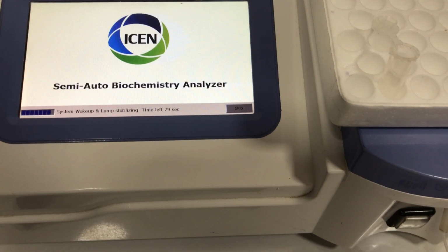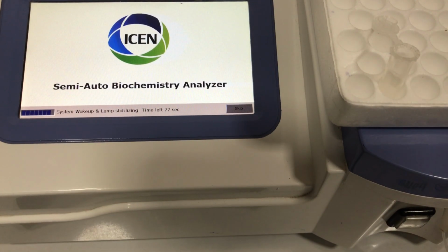Hello and welcome. In this video, we're going to learn how to measure the creatinine of a sample, and we are going to use two different types of reagents. So I'm going to show you how they are used, even though their principle and the way we do them is the same.